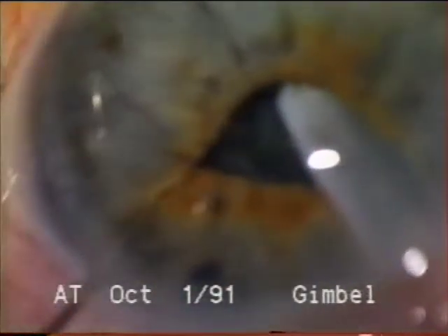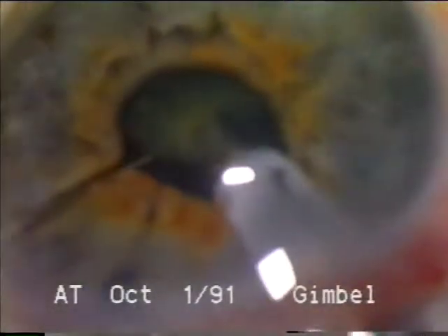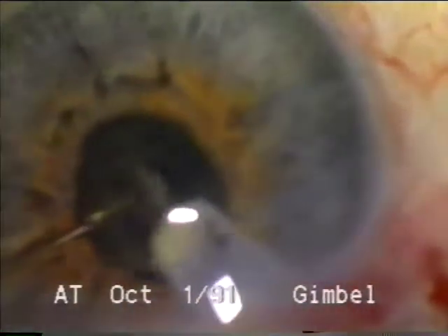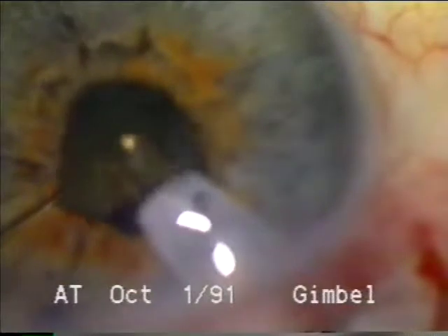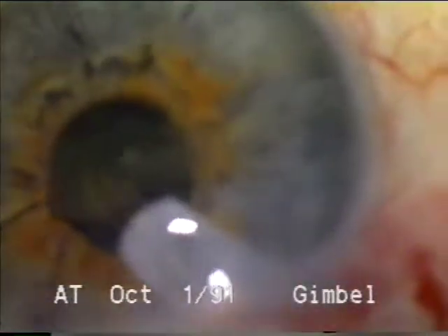This is edited down slightly. The phaco time here is 3.4 minutes, and the total energy in this case is only 0.99, indicating that we're working at about 35 percent average phaco power. So it may take longer, but there isn't much turbulence and much phaco energy utilized. Note how little the phaco tip moves and how much the second instrument is used to maneuver the material to the phaco tip.